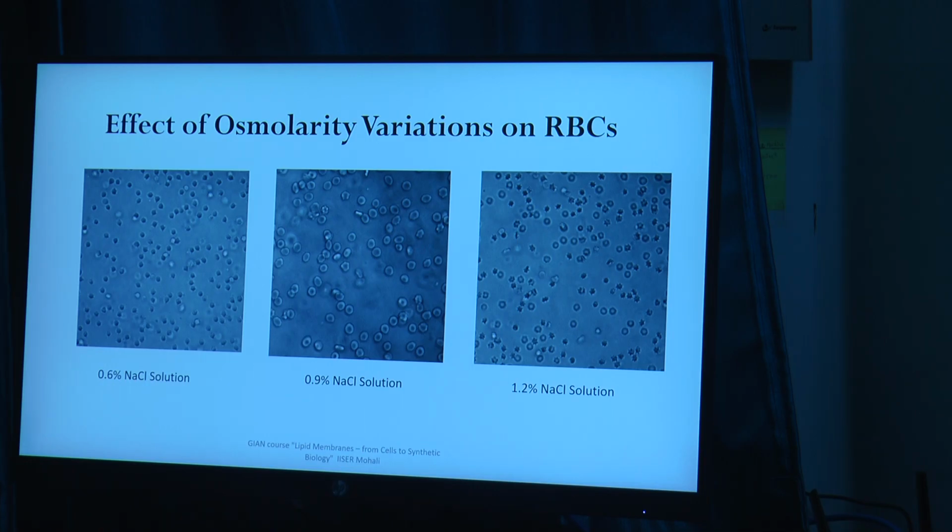Now you are in groups of 3. What you are going to do is dilute it with respect to your saline solution. You are going to incubate it for 15 to 20 minutes, and after that, for your salinity, how the cells are going to react is something you are going to observe in the microscope.